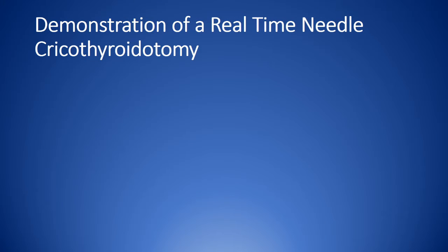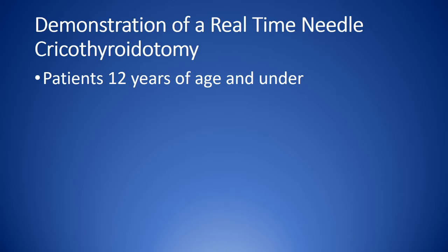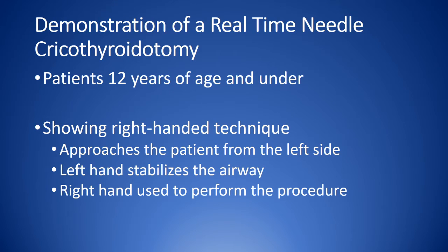At this time we are going to demonstrate the needle cricothyroidotomy in a patient age 12 or under in real time. I am a right-handed surgeon, so I will approach the patient for a needle cricothyroidotomy from the left side so that I can use my left hand to stabilize the airway and use my right hand for the procedure.